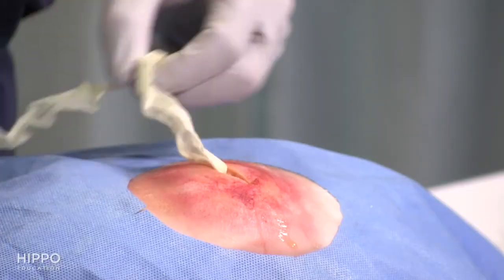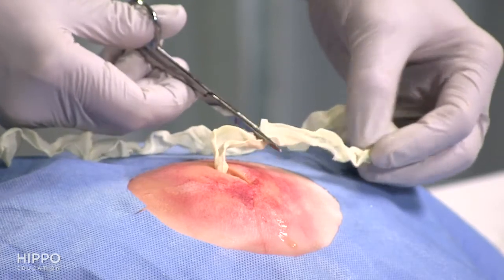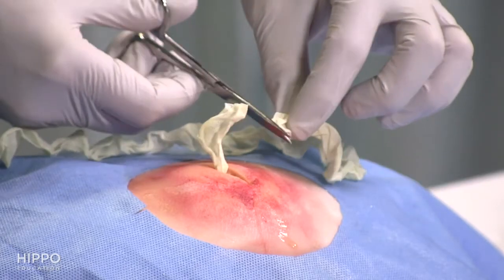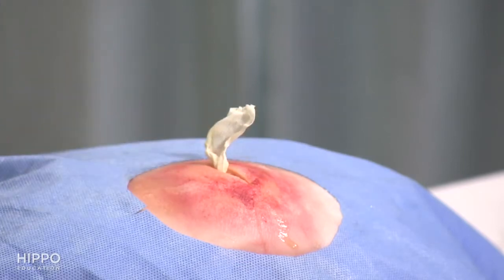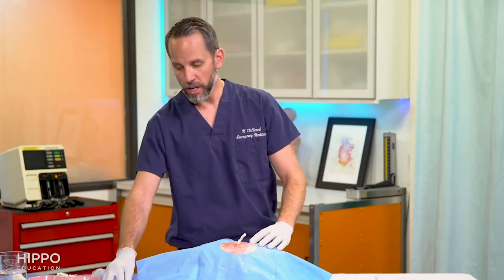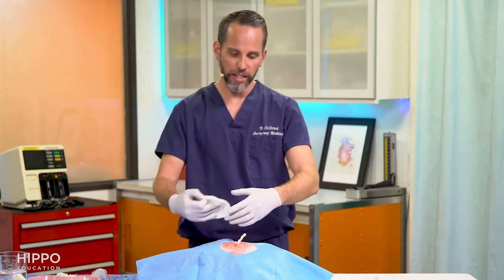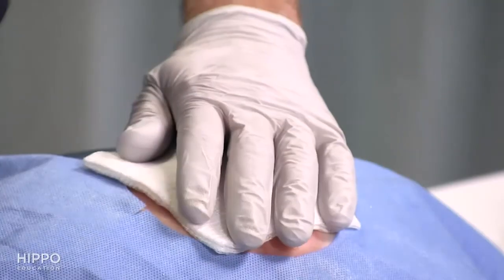That's pretty much it for this packing. You can see I've got some excess. I cut off a tail. You obviously want to leave a tail so someone knows that that's in there, and that way you have something to pull when you remove it. The last step at this point is just using an absorbent gauze dressing. This is going to drain over the course of the next couple days with that packing in there, and you just want a bandage that's really going to pull that off.